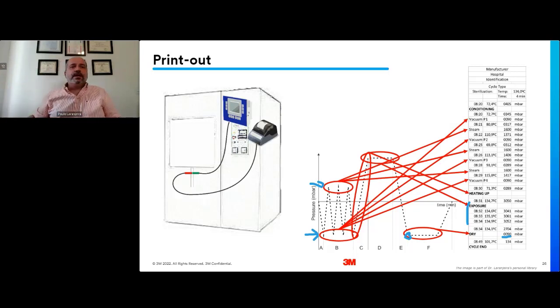So that's why in a graph, you're always going to see that the first pulse, or when we start the drying phase, is going to be the deepest point of the cycle, but during the drying phase, that point rises, and that's related to a reduction of vacuum efficiency, because of heat and excessive condensate formation evaporation during the cycle.